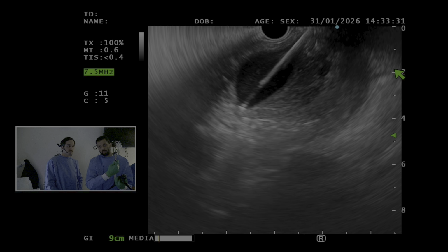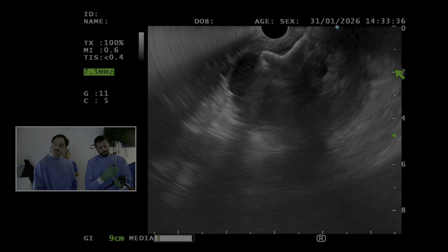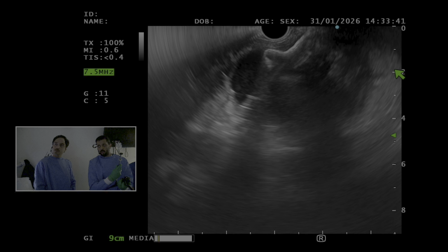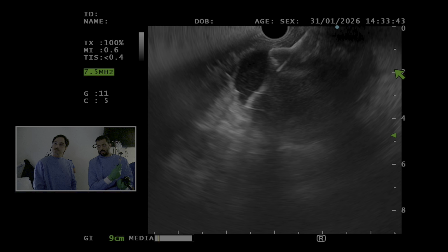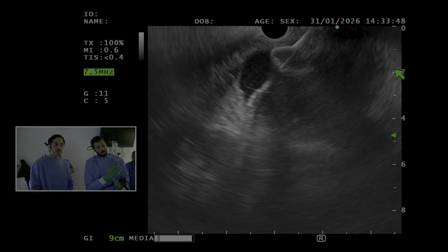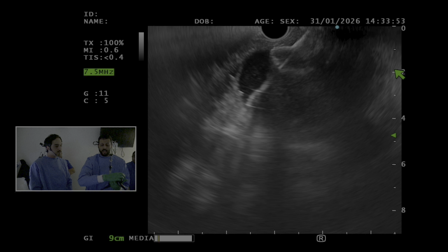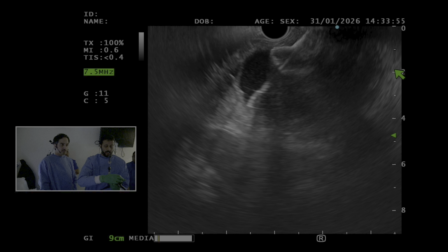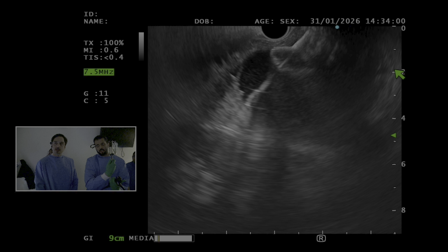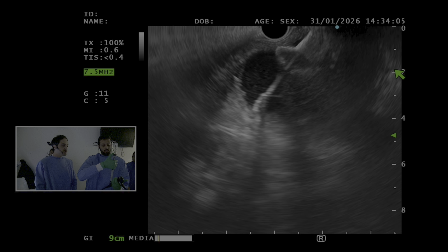So here we go. All right, so here you can see the inner flange, perfect. And then after that, I try to snug it so we can get the football shape until the catheter touches one of the lips. Now I'm good. Now I'm gonna unlock, and then deploy my endoscopic flange, and then I usually unlock in this area, so I can have much more flexibility in terms of deployment. So you do intra-channel deployment for the second flange. So this is done blindly.